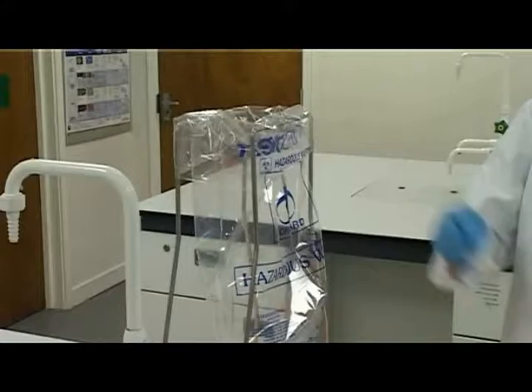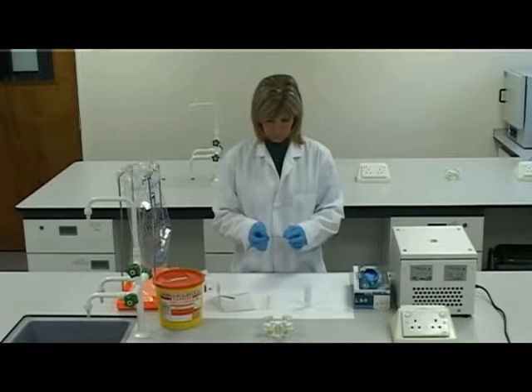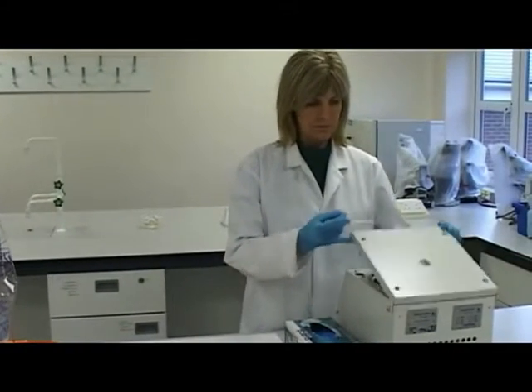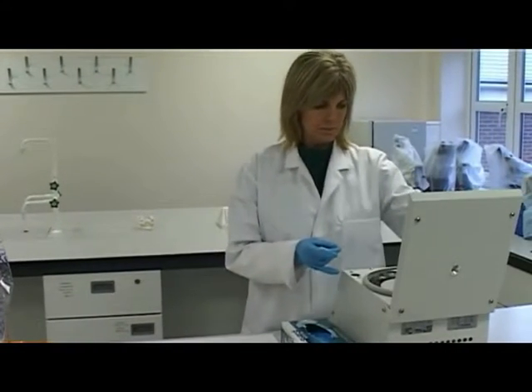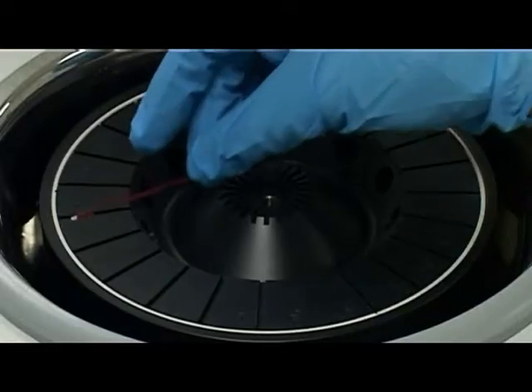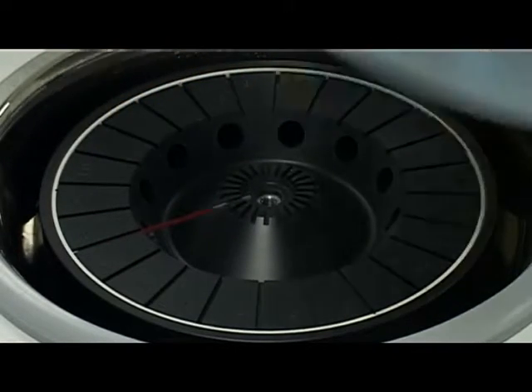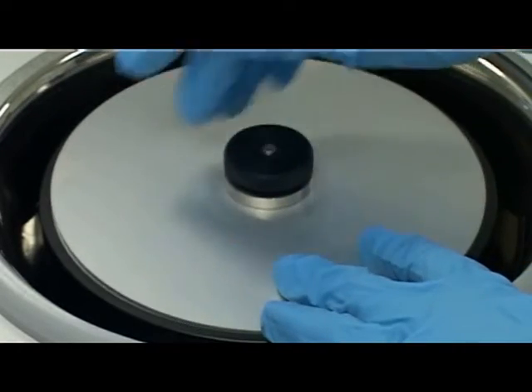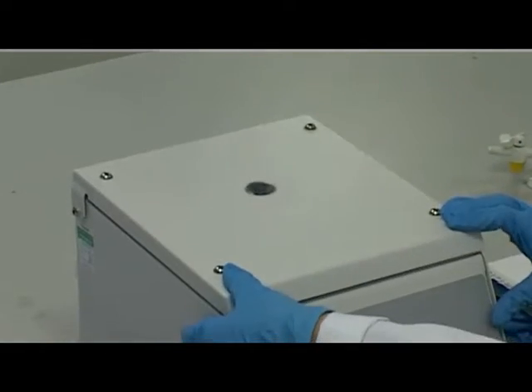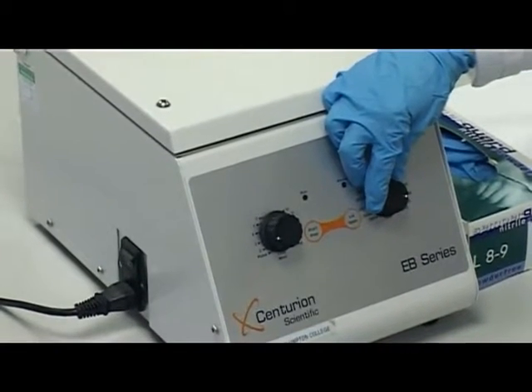Dispose of clinical waste appropriately. Ensure the capillary tube is at least three quarters full for a diagnostic PCV. Place the capillary tube into the micro-haematocrit centrifuge with the clay plug against the outer rim. Screw the inner safety lid down. Close and lock the main lid. Set at 10,000 revolutions per minute for 5 minutes.